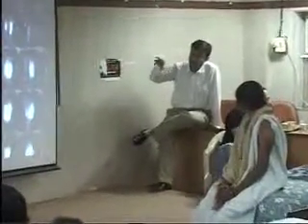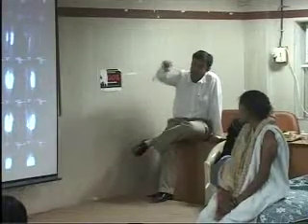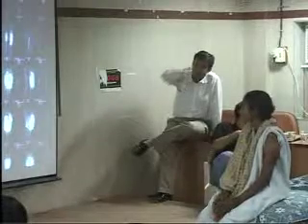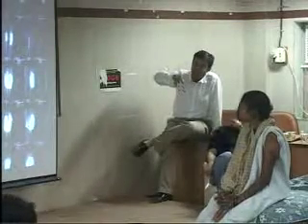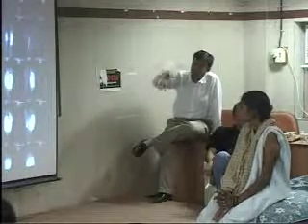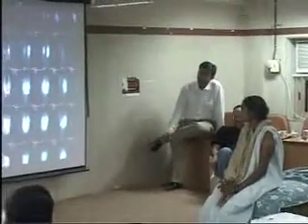Chadha was saying. So depending upon what we want to see, whenever there is a tumorous lesion, after doing the fat saturated, we want to see how it is, whether there is any infection or whether there is any tumorous involvement of the bone or the decortication. Now how the vessels are looking, that we need to see. For that we will request a STIR sequence when we are suspecting a tumorous lesion.